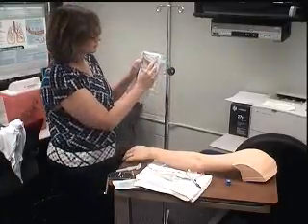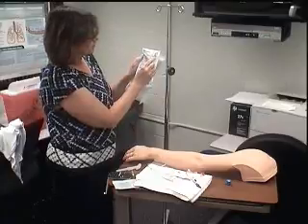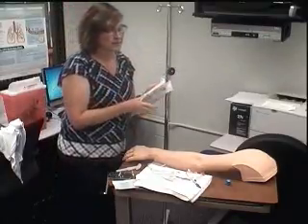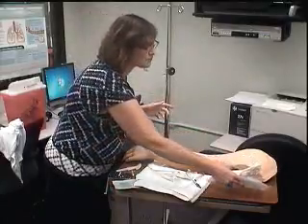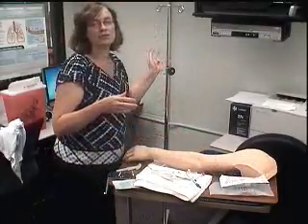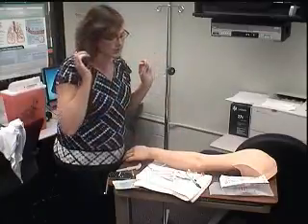The drops are up here in the corner, 10 drops per ml. So I'm going to make sure to note that, the 10 drops per ml, because that's going to come in handy when I actually hang that fluid. If I have to count the drops, I'm going to need to count those drops, and so I need to know what that drop factor is.